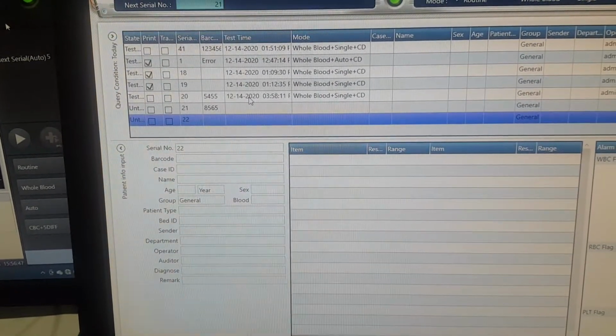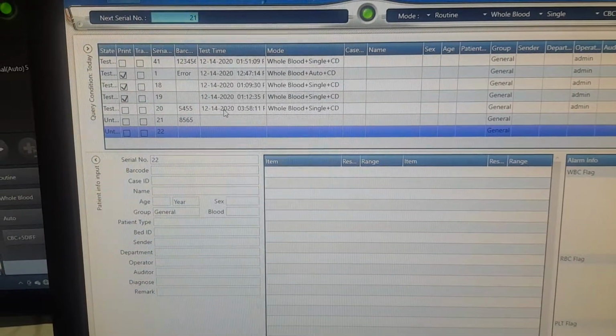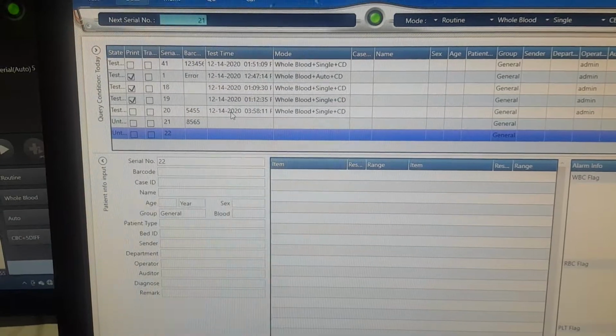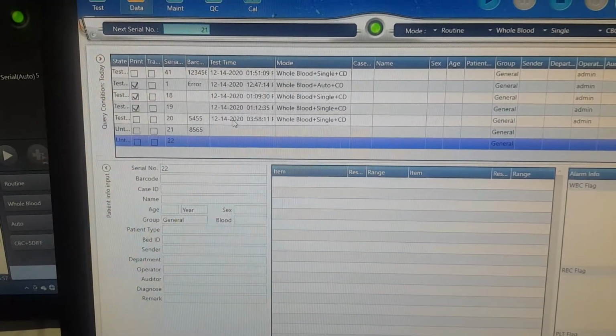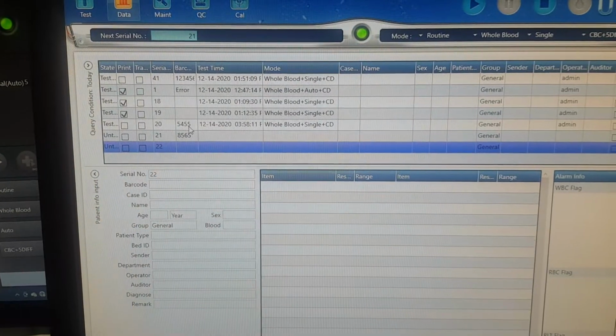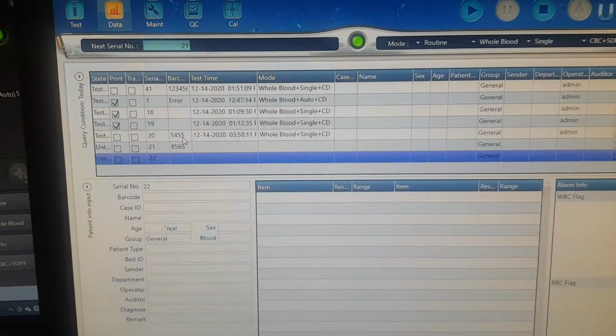So that means when I create the work list, an analyzer also analyzes the sample according to the work list, and it gives the serial number and barcode ID as we already input those ID.